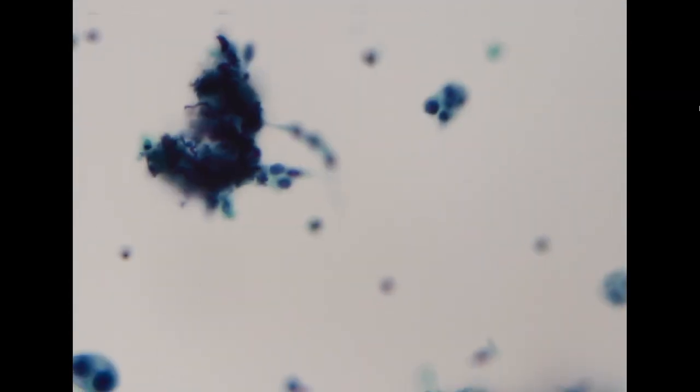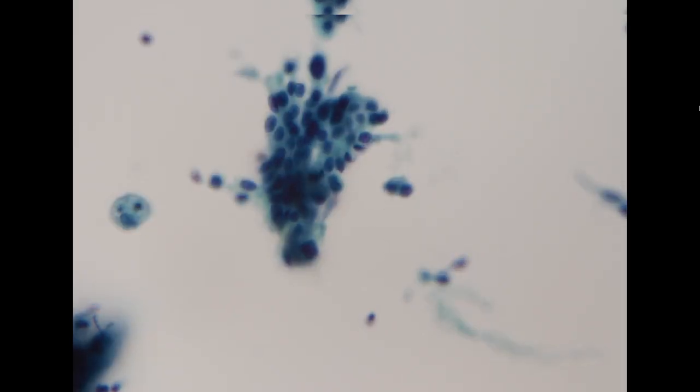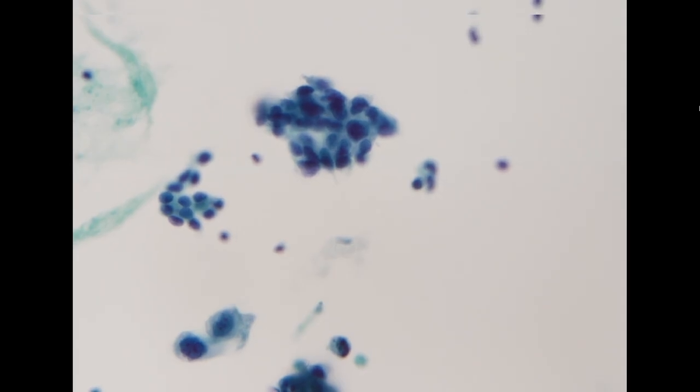If it is a primary parotid gland tumor, the most likely diagnosis is a salivary duct carcinoma, which is basically a salivary gland analog of breast cancer. It will show similar morphological features, like a squamoid type of feature. It can be de novo or it can arise from a pleomorphic adenoma, so it can be a carcinoma ex pleomorphic adenoma. Additionally, it can also be metastasis.